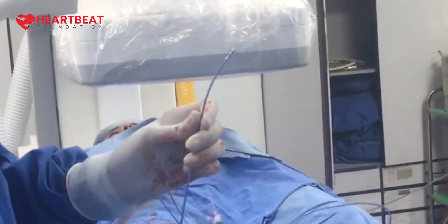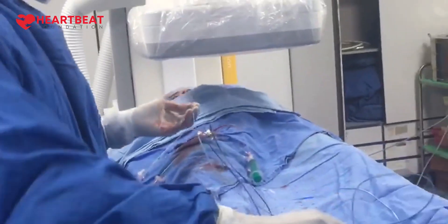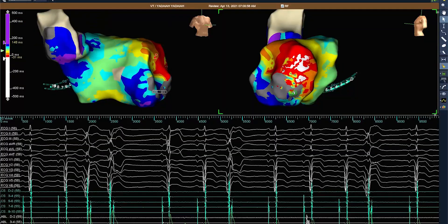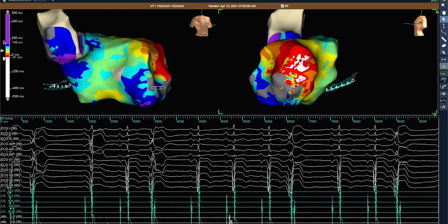As you can see, we have punctured three veins and taken the catheters inside. This is the computer system showing the arrhythmia; we then locate it. Next, you can see we have taken the ablation catheter and are delivering controlled thermal energy — radio frequency energy — at the specific location responsible for the tachycardia. We ablate it, and after that the patient is sometimes cured of the disease, depending on the type of diagnosis.